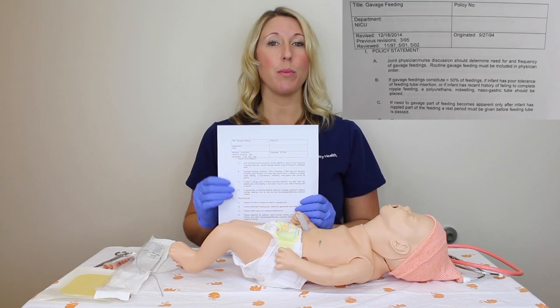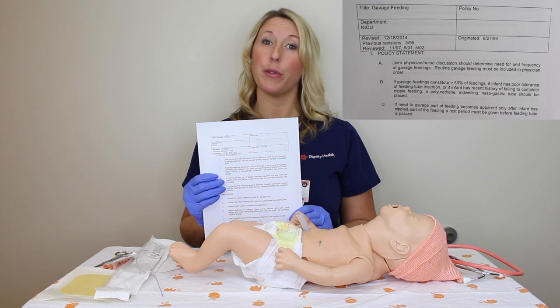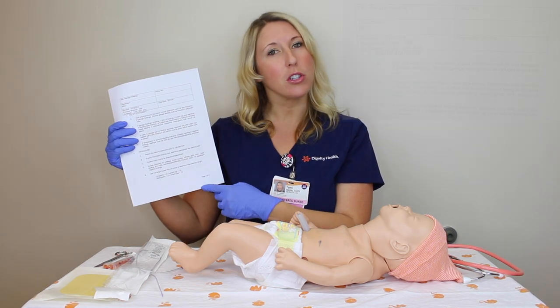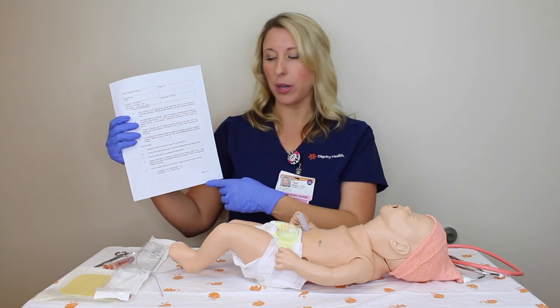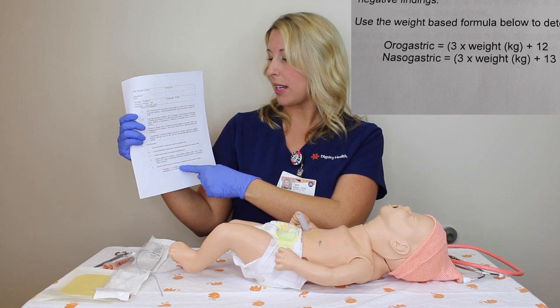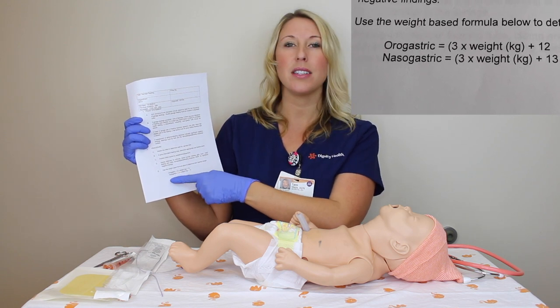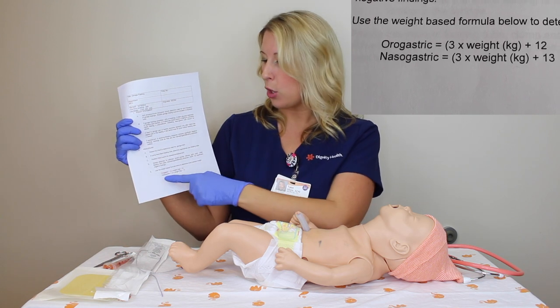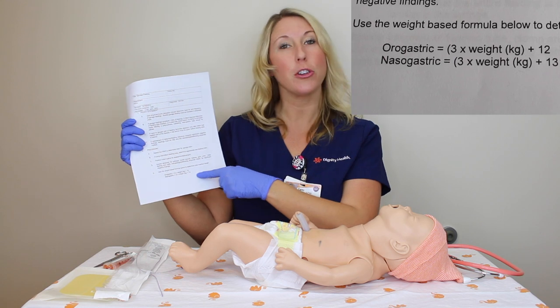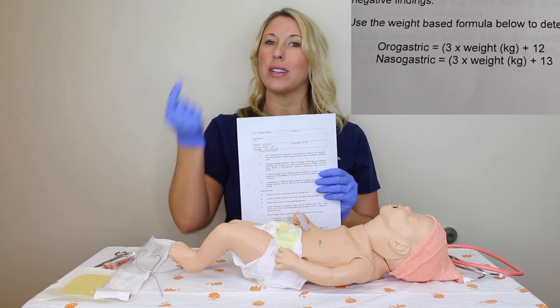Per our policy, you must know how to measure for placement before inserting the tube. The policy is located in Policies and Procedures on the WOWs under the CODI system. For oral gastric placement, use 3 times the weight in kilograms plus 12. For nasogastric placement through the nose, use 3 times the weight in kilograms plus 13. That number is what you go off of when inserting your tube.